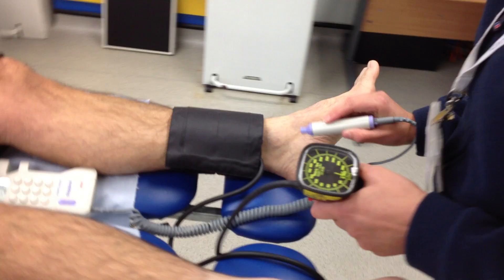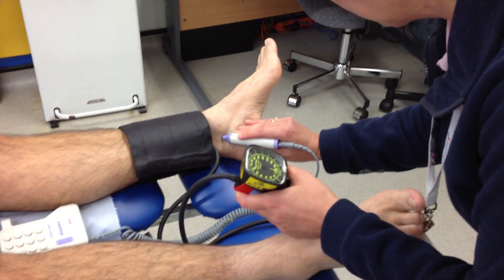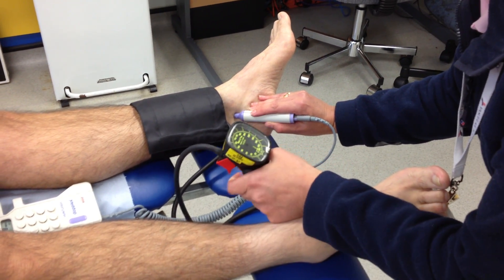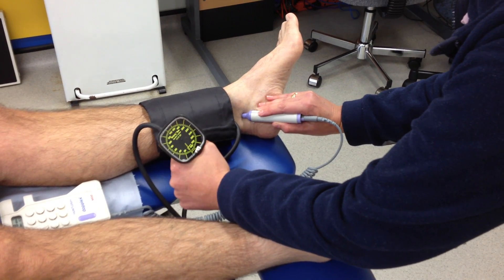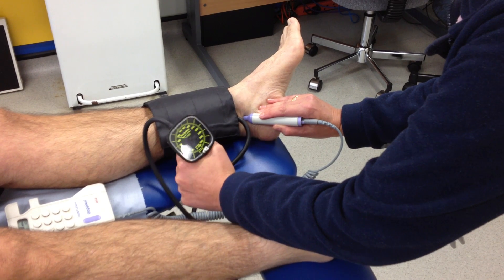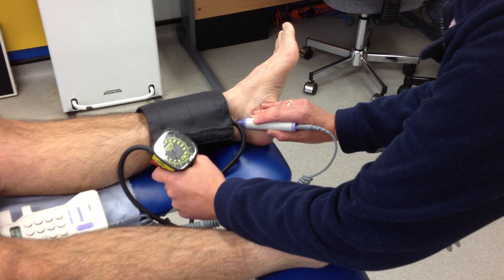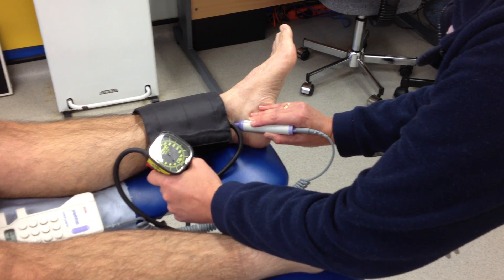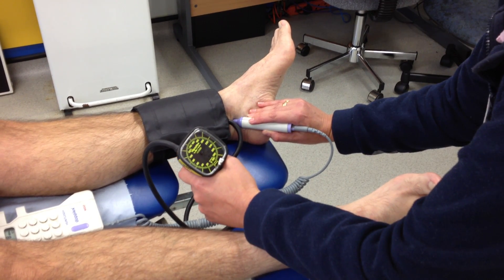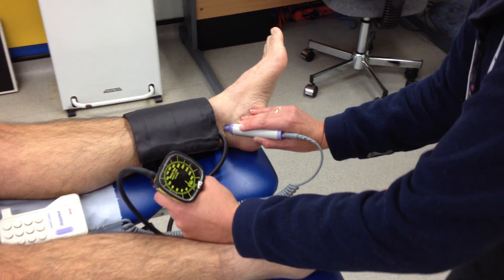The cuff is fully deflated and now the posterior tibial artery is located. Again, the hand is anchored firmly on the foot so that it doesn't slip off the pulse. And again, the results are recorded.